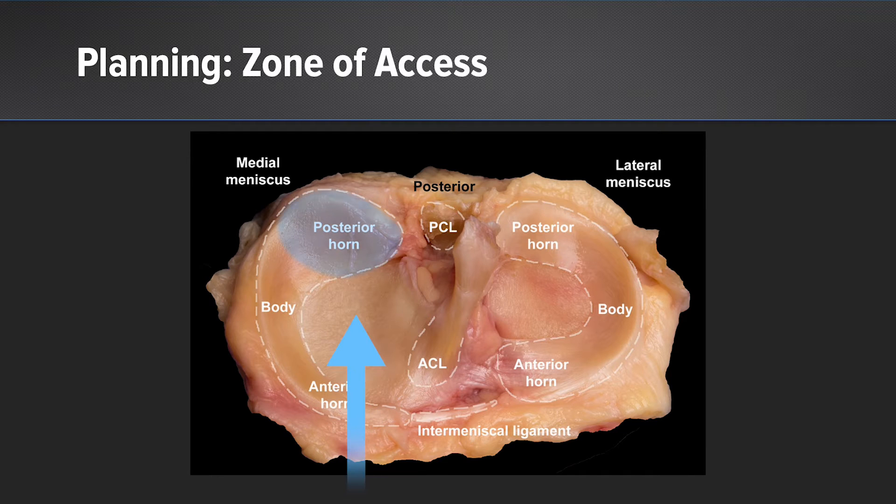With all inside from an ipsilateral portal, I can reach the posterior horn very well. From a contralateral portal, I can also reach the posterior portion of the body. But if that tear extends beyond, we might need other options such as inside out.